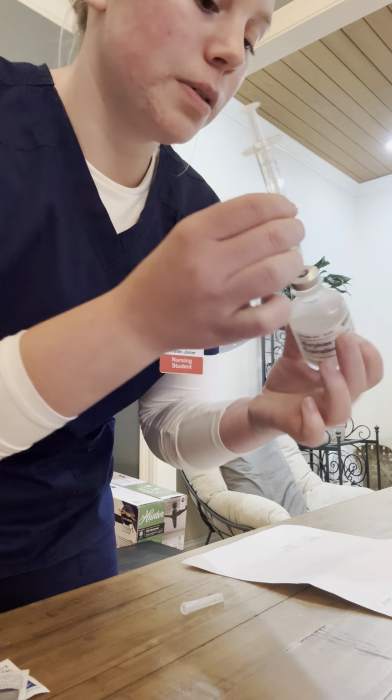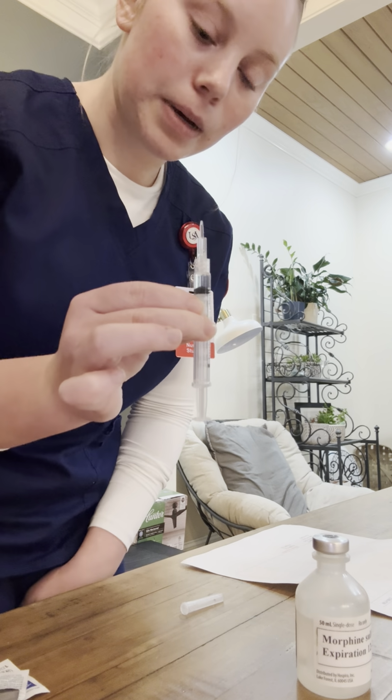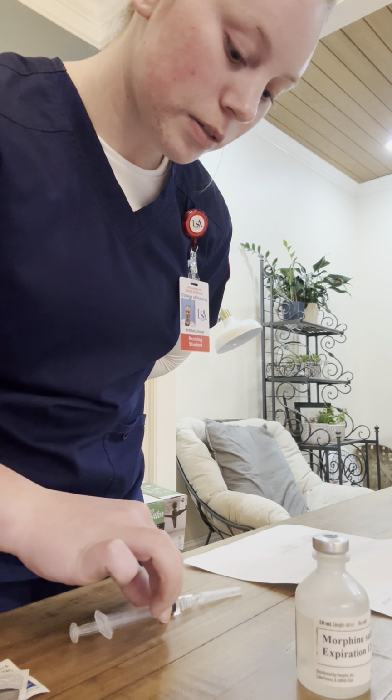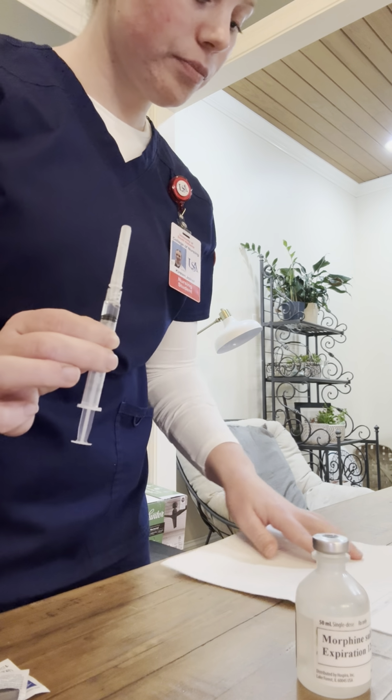All right. Now I'm going to use the scoop method to recap my syringe with the blunt cannula. So I'm going to put a hand behind my back, just like that, and click it on.